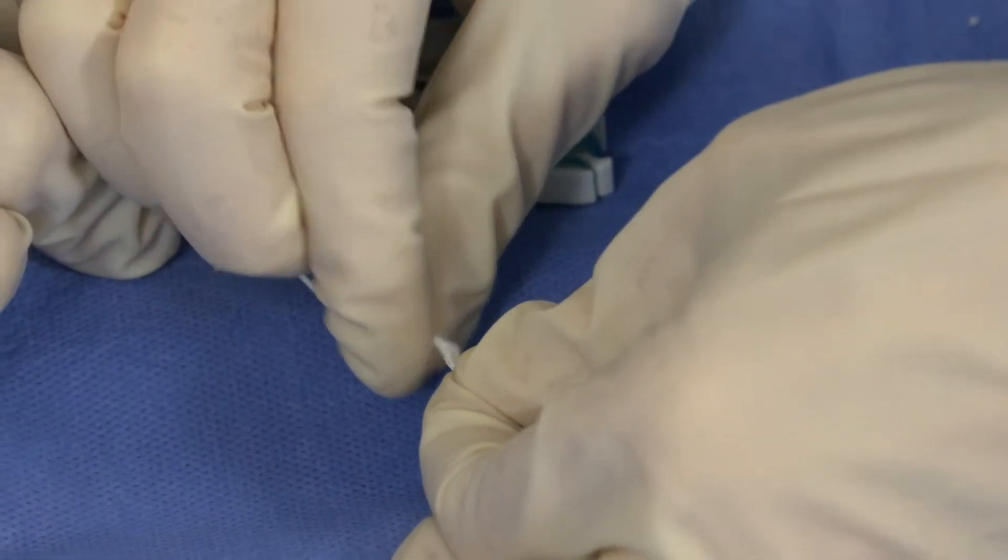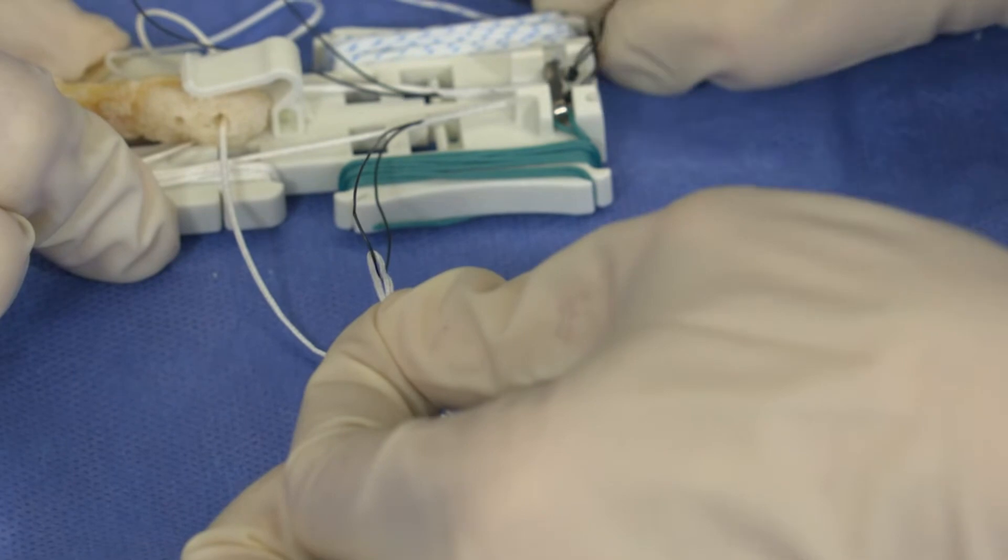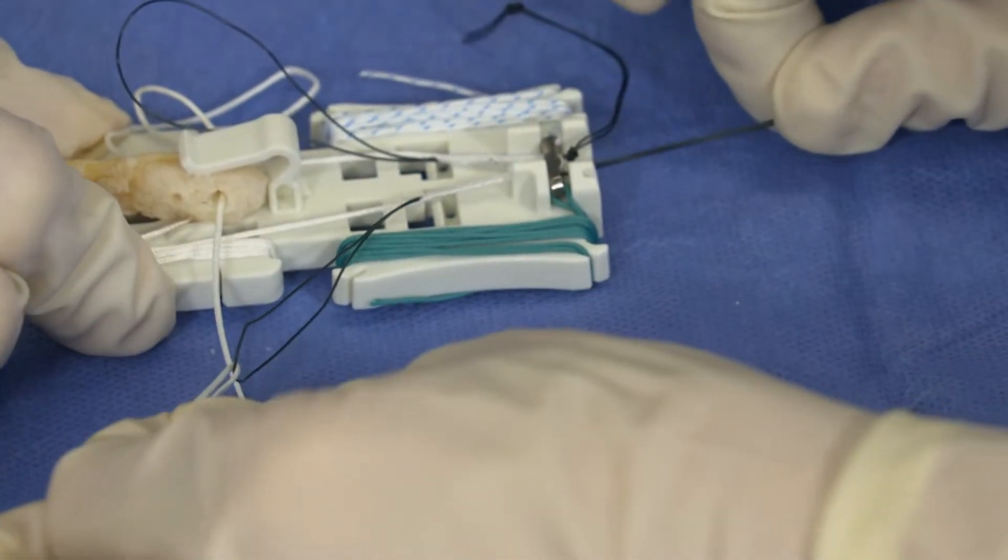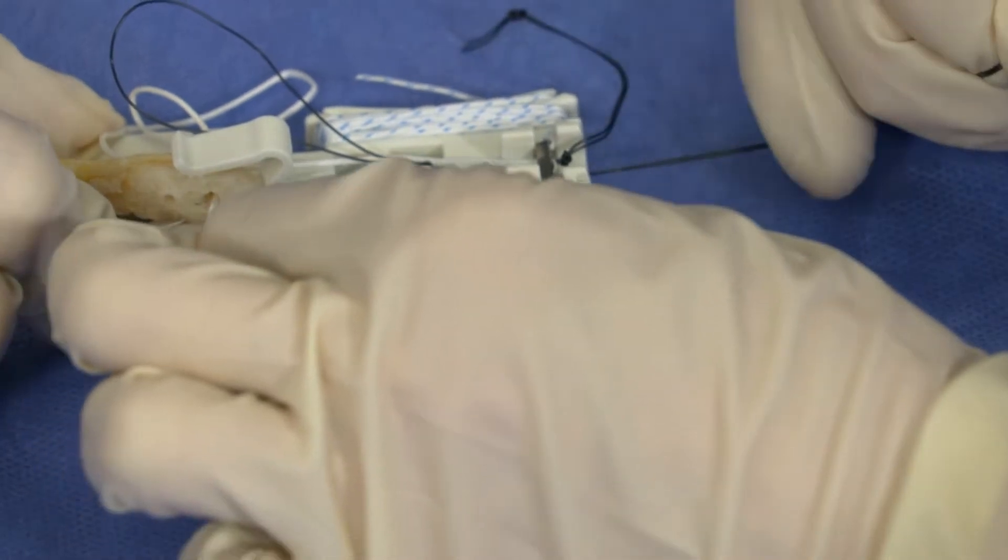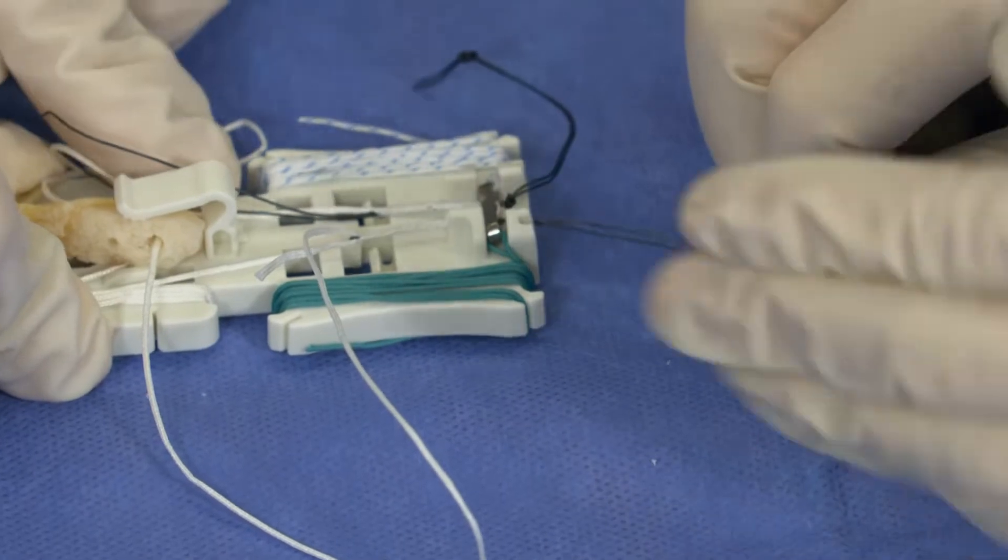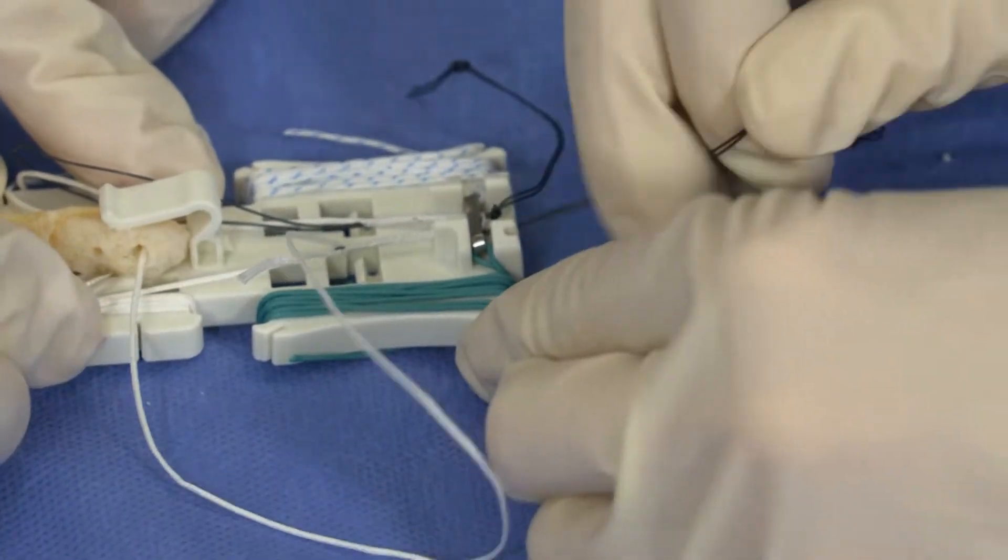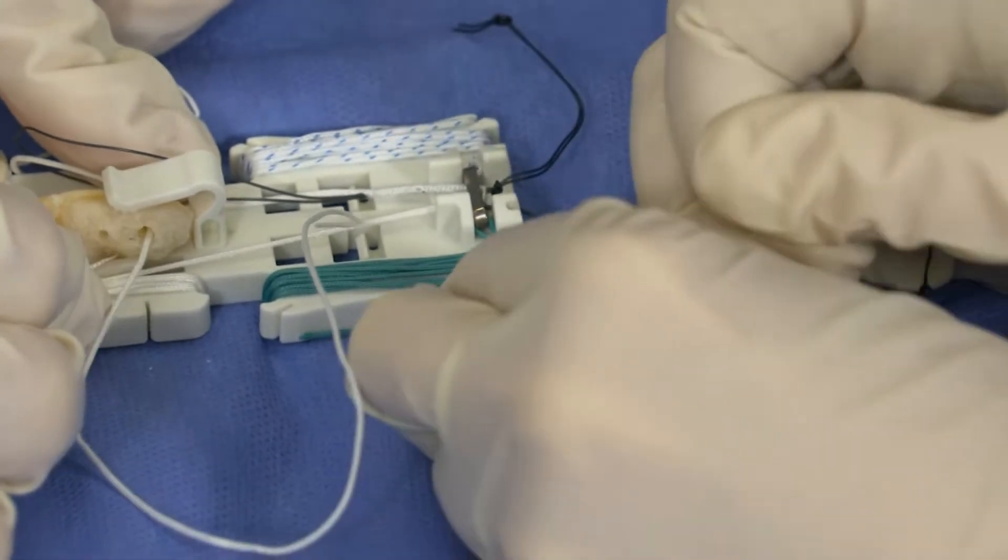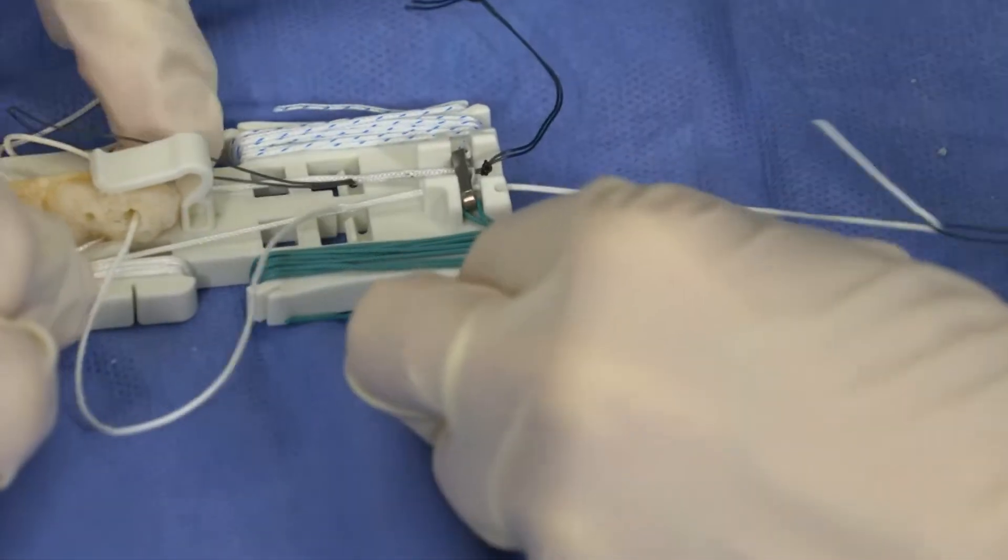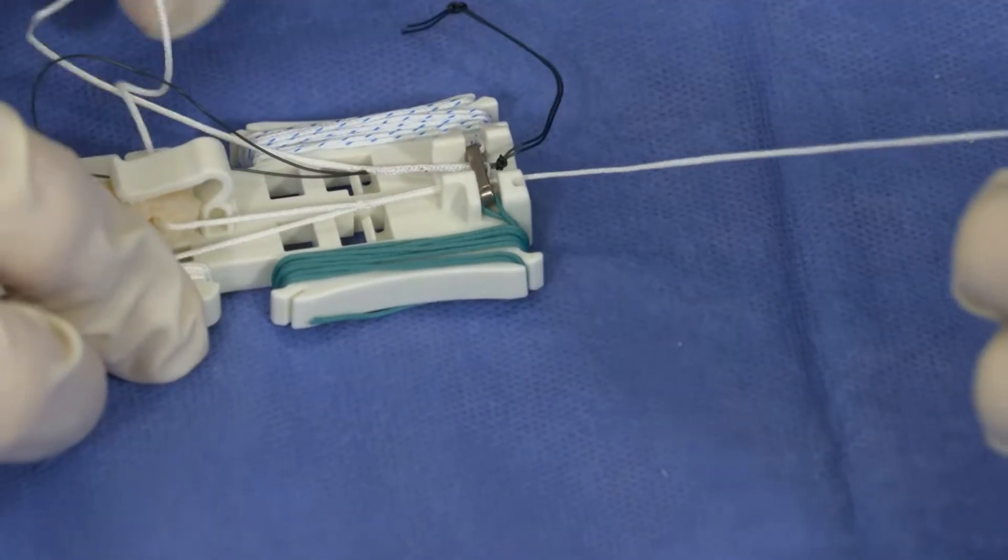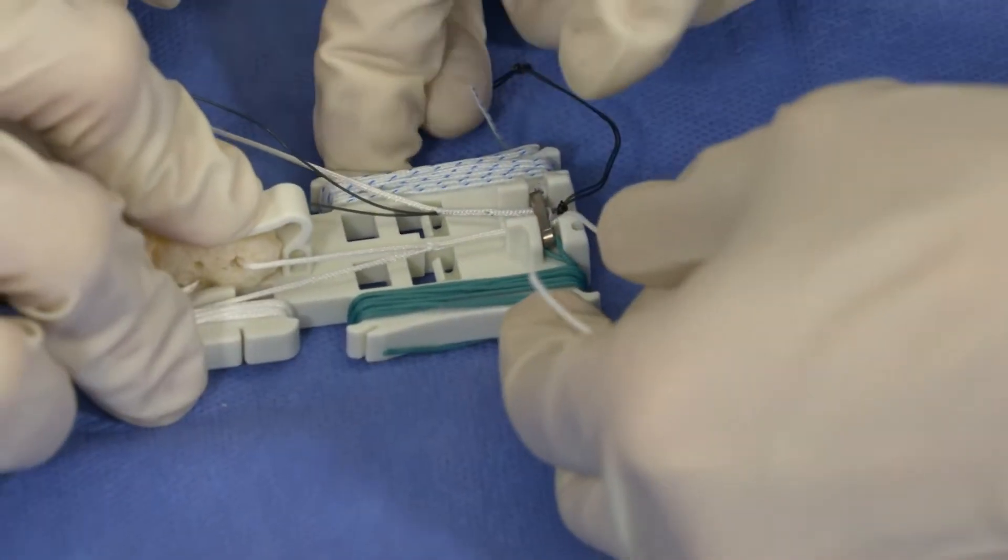Pinch the end and then with the corresponding edge of the black relay loop you're going to be feeding the tensioning suture through the button. This will be through lateral side to side movements pulling in line with the base. Then the tensioning suture gets fed through. The white suture can then be wrapped around.